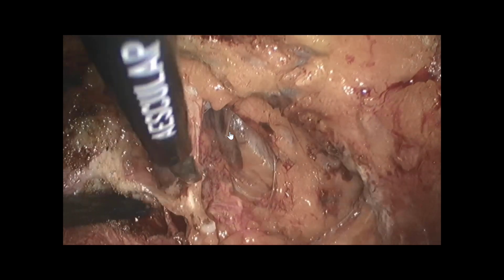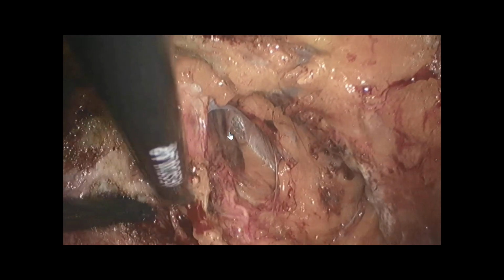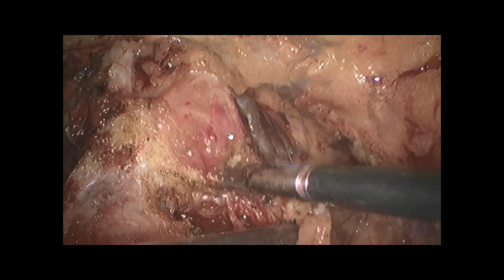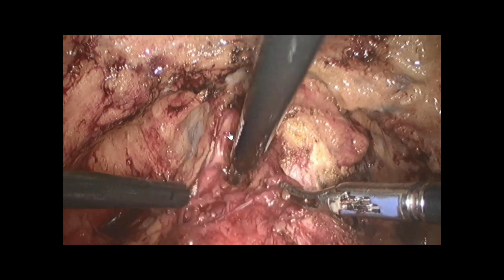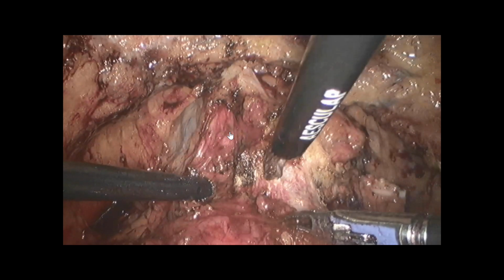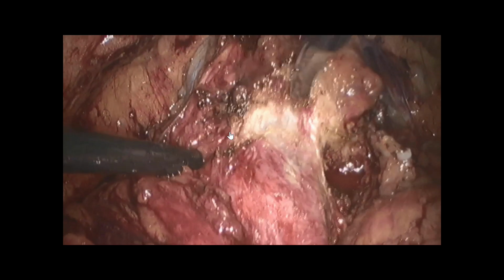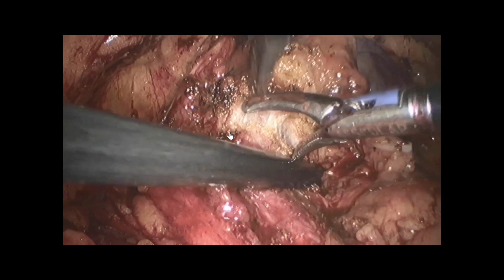So here it's not the neurovascular bundle, it's just the vesicoprostatic pedicle, very small bleeders. And this is done on the right side. And on the left side, you see here, very important, sometimes you see some vessels. These are pudendal arteries. If you see a vessel like this, try to spare them, because sometimes these vessels are the main vascularization of your sphincter, and if you cut it, sometimes you have bad results just because of this.